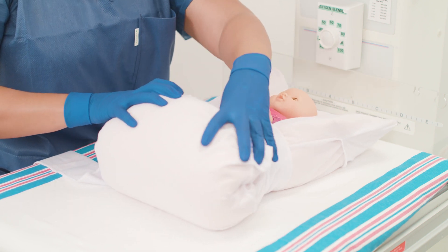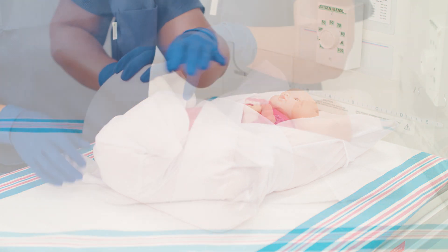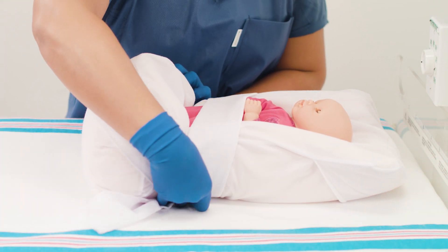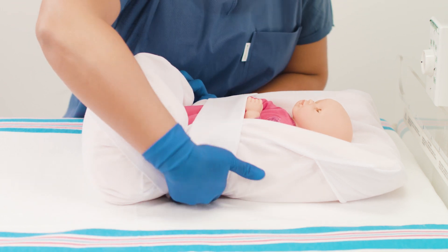Bring it up to cocoon the feet and legs, making sure it doesn't crowd the infant's feet. Finally, wrap the second strap around the positioner's length to hold the bottom of the positioner in place.